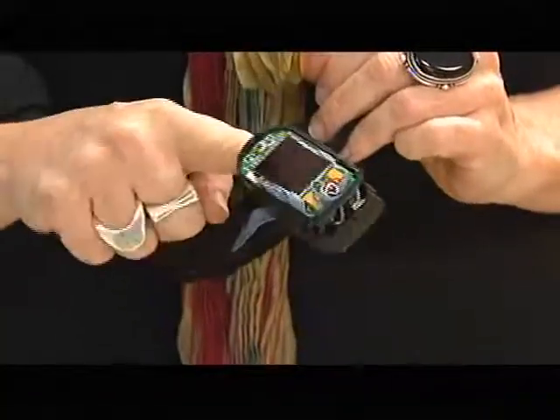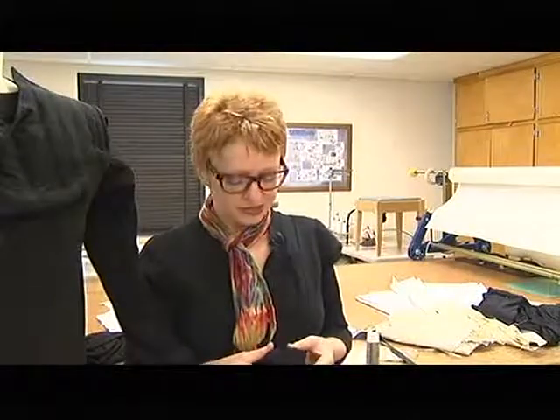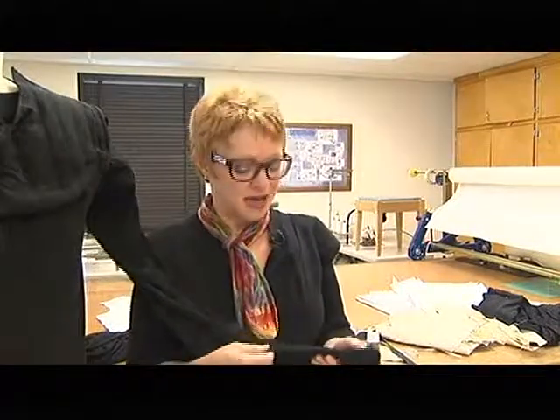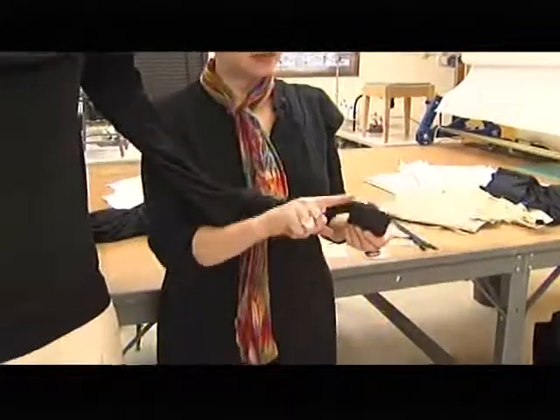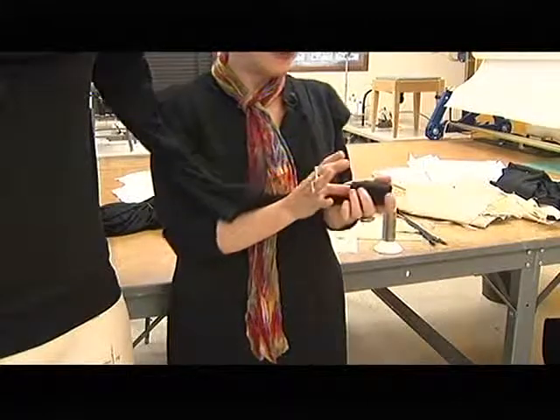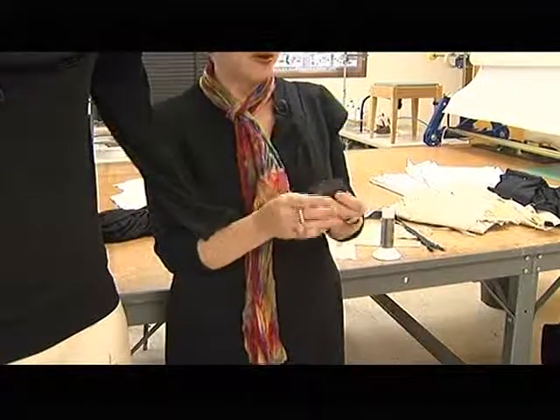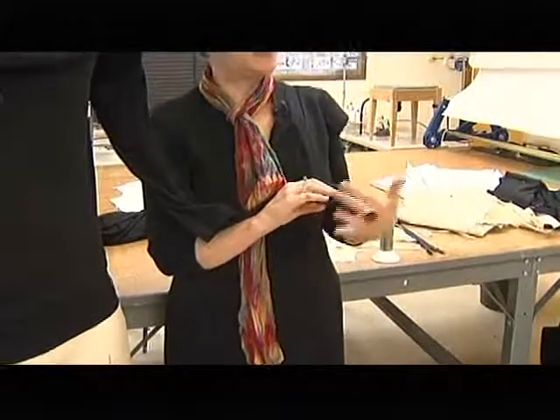The shirt also had to incorporate a fingertip oxygen saturation monitor. Through my collaborators, I understand now that which finger this goes on is very important. When we were deciding on the shape of the part that covers it, if it went over the index finger, it would have one shape. So we were thinking, too, that if it went on the thumb, that might be a little easier. When you sleep, you might curl up your hand. But no, it needs to go on the index finger. And it just doesn't give us as good a signal if it goes on a different finger.